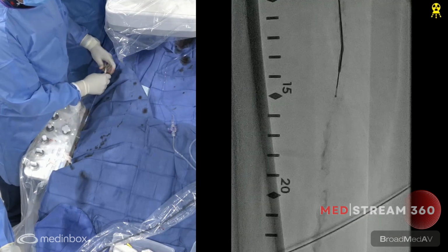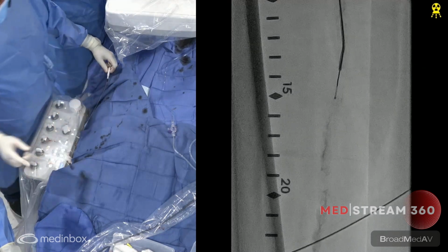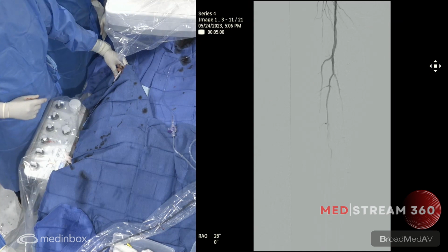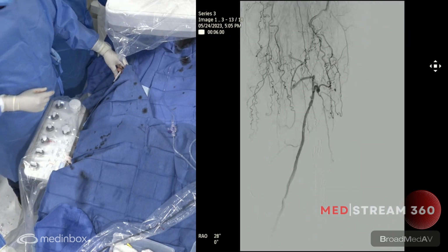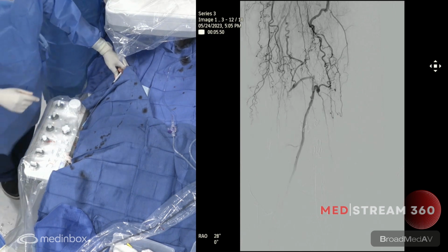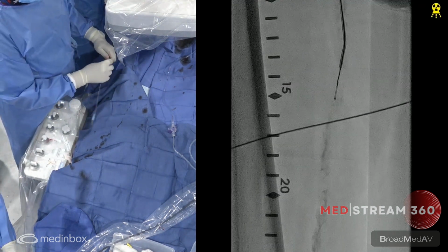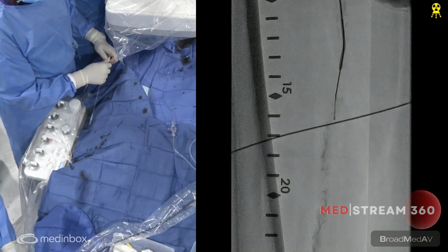Let's see. I think if we go to the last view, where does the occlusion come back? It's always good to look at our pictures to see what number it comes back at. Let's see. It's around 20 is what I thought. So we're pretty much across 15 or at 15 now. So let's see if it pops further. There you go. You see that? See how it's just trying to find the fenestrations?